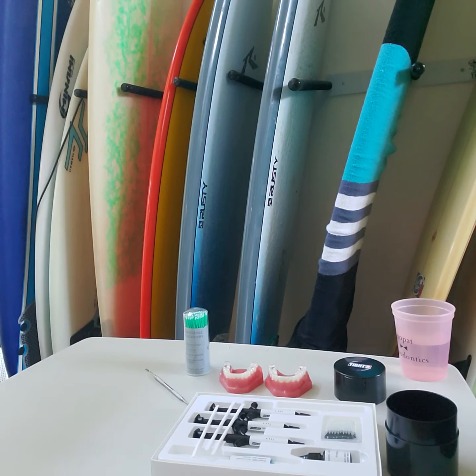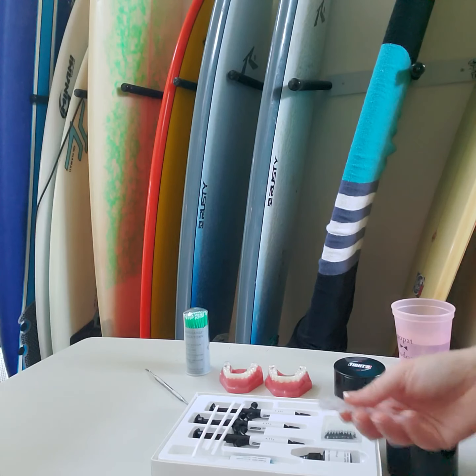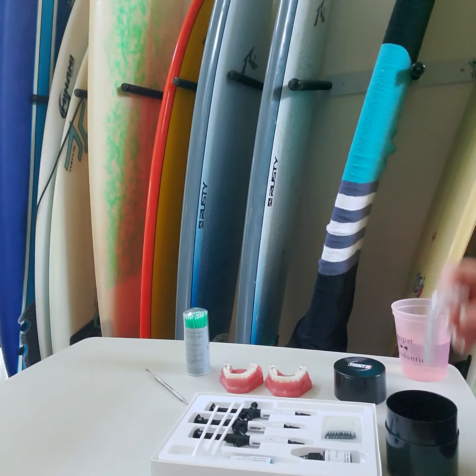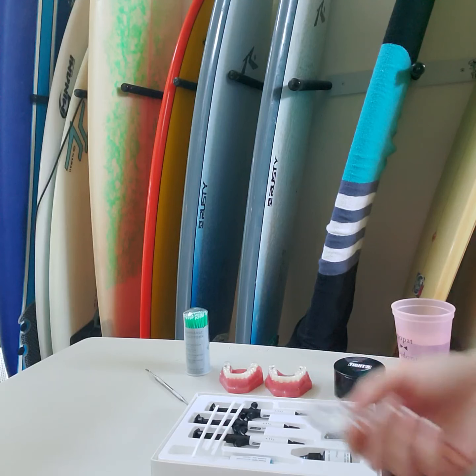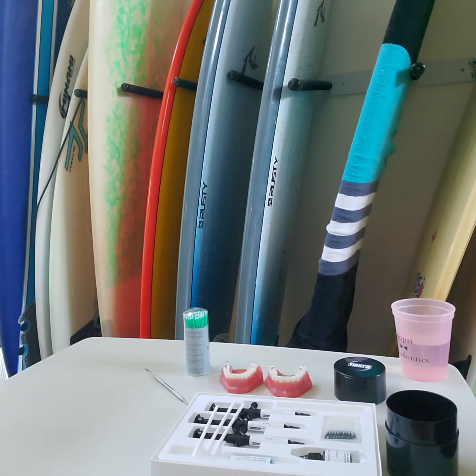I would recommend that you do a lot of practice filling the tray because you really have a short period of time to do this before the material starts to harden. So don't practice on your first patient. If you talk to an Invisalign rep, they can probably give you some old discarded trays that someone didn't use, so you can practice on them. Or if you have an orthodontist that you occasionally refer to, usually they have tons of samples. So I would get a bunch of practice ones ahead of time and practice so you can get your speed up, okay?